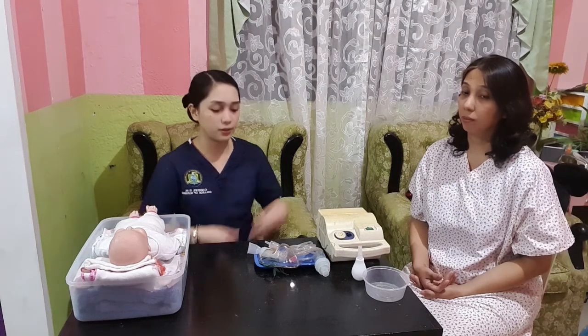Next is to assemble nebulizer equipment per manufacturer's direction. So assembly may vary slightly with different manufacturers. Proper assembly ensures safe delivery of medications.